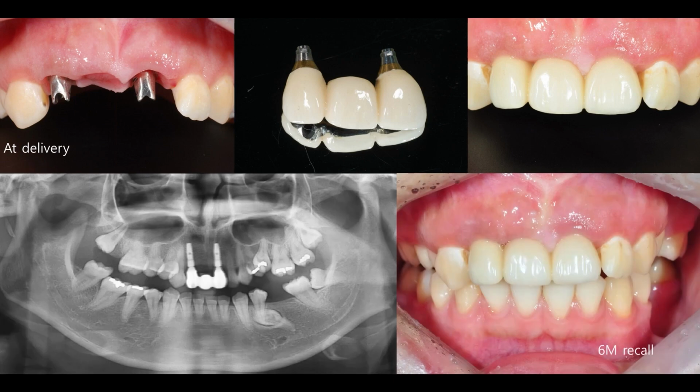This is the X-ray image after surgery. This is at 6 months. The patient had a little bit of disability, so the patient couldn't brush teeth properly, and caries continued to occur. Compared with the initial visit, the lower anterior is quite visible, and the alignment of the upper anterior has been improved significantly. Therefore, the patient and the caretaker were extremely satisfied with the treatment results.